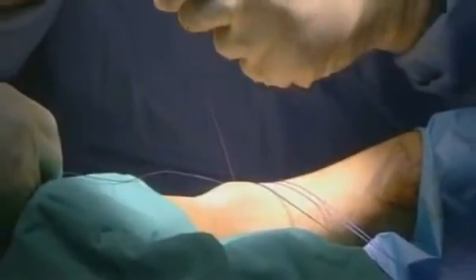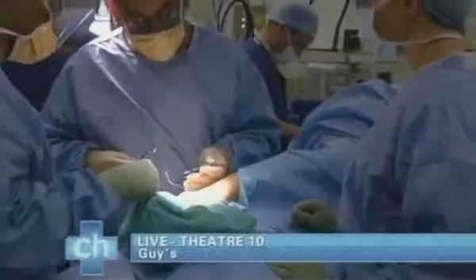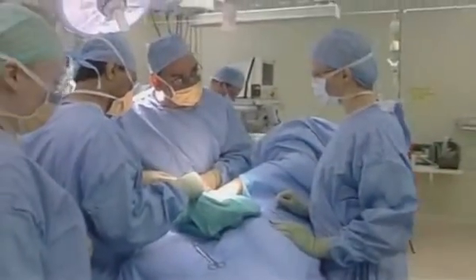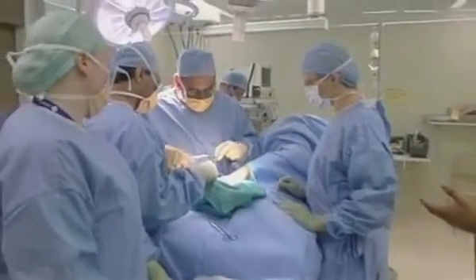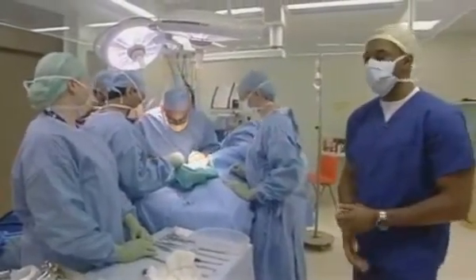Thanks, Ainsley. Now, Mr. Singh, may I ask, what stage are you at now? Yeah, we've done the bony groove. Now we're just repairing the soft tissue that had been pulled off, and we're putting it back so that we can bury the tendon nice and deep within the groove. And then you'll stitch the outside? Stitch the outside, yep, and then we'll close up the wound and then put a plaster on. A bit of plaster? OK, well, thank you for that for the meantime.